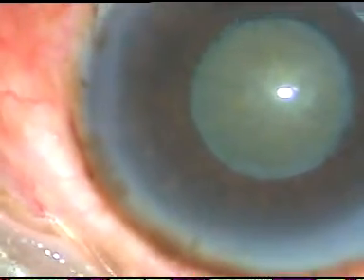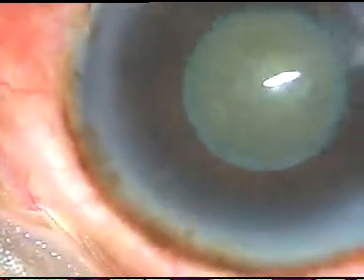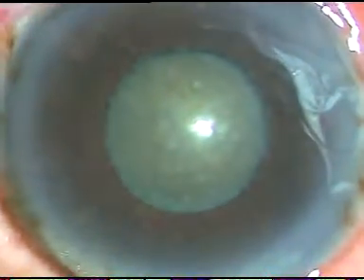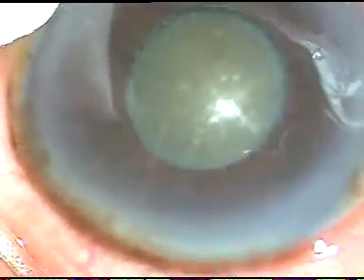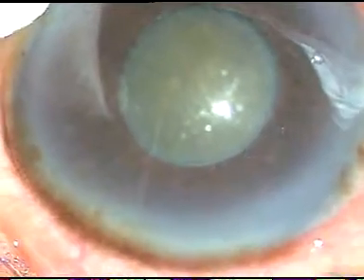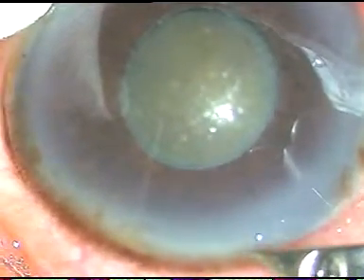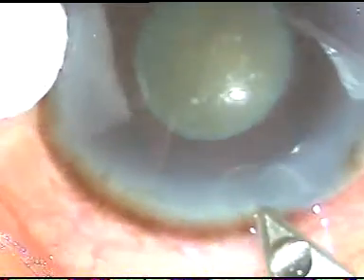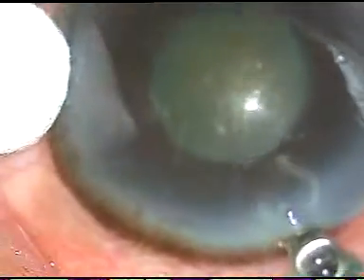Dear colleagues, this is a very interesting and quite challenging case. We can see this is a hard cataract with small pupil and there is white flaky material along the border of the pupil. So this patient has pseudo exfoliation. We have started the case. Let us watch the surgical steps.